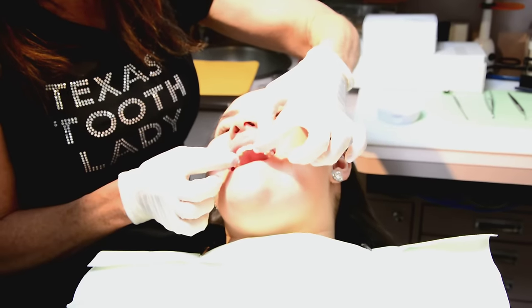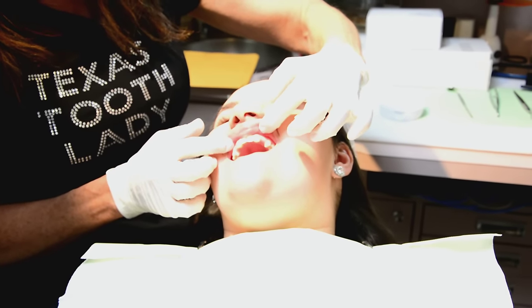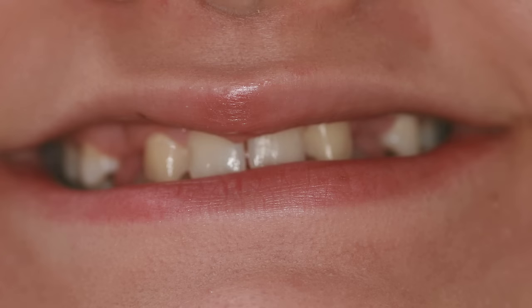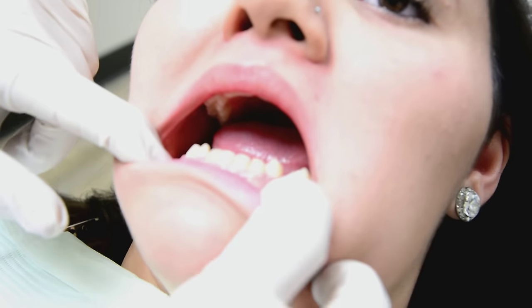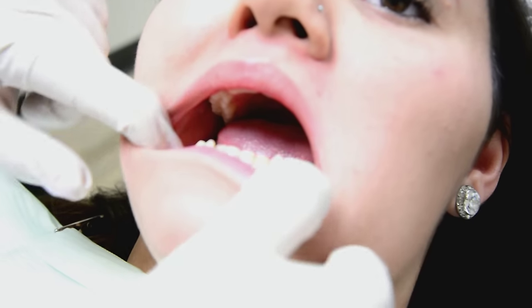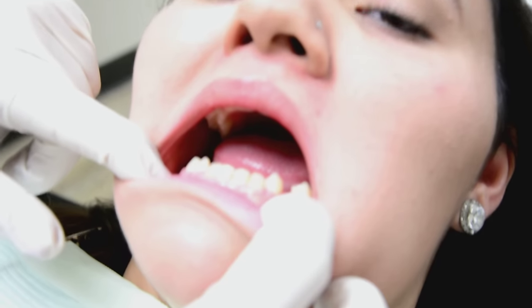She is congenitally missing her laterals, and her cuspids have moved into the lateral position, which has created a space in the cuspid position bilaterally. On her lower arch, she's not missing any teeth on the left — she just has a space. And on the right, the same thing — she just has spaces.